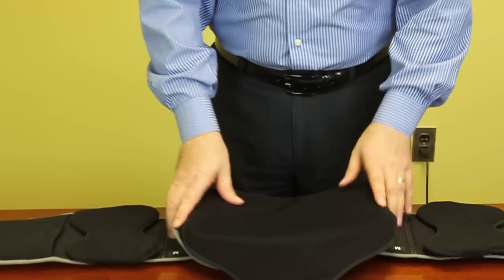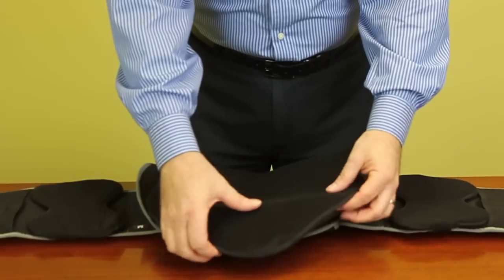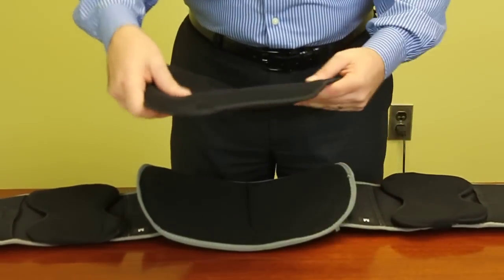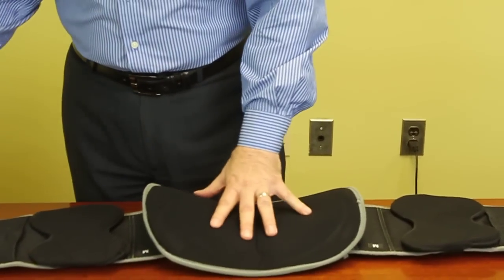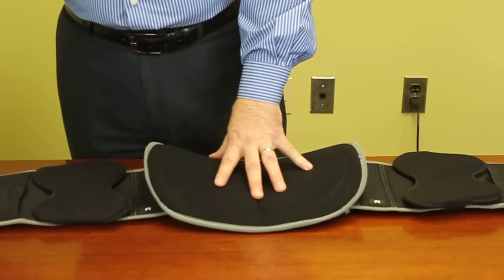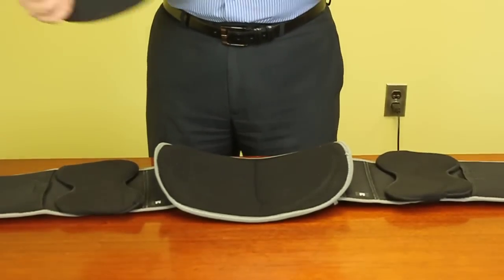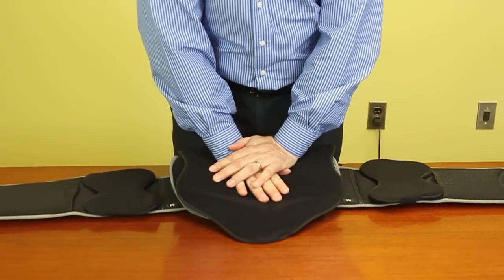With this particular device, with the L0637 code, it has the upper back for complete support for the patient. But with this particular brace, you can remove the complete upper back so that if a patient doesn't need it at any given time, they're able to use just the mid-back support, which makes it a lot more comfortable. But if they then need the extra support for the upper back, all they need to do is with the Velcro, just put it back on. So this serves as a dual purpose for the patient.